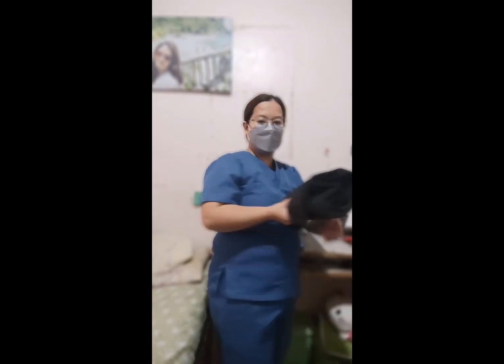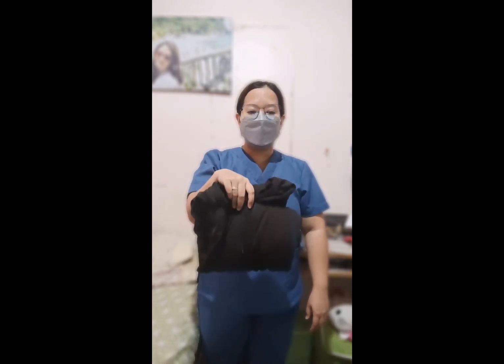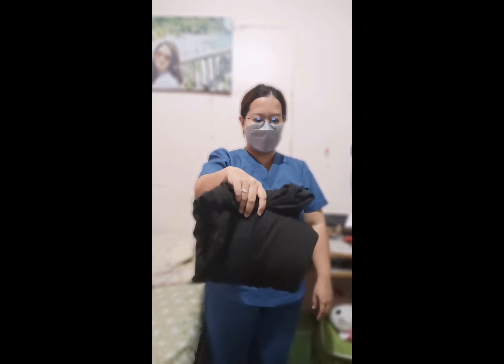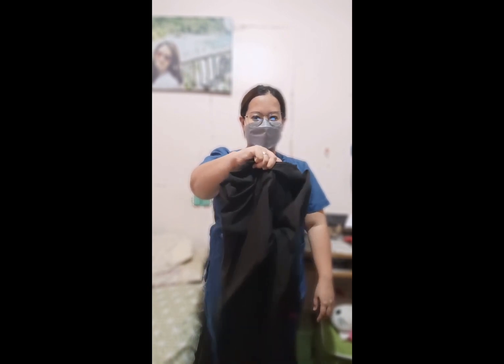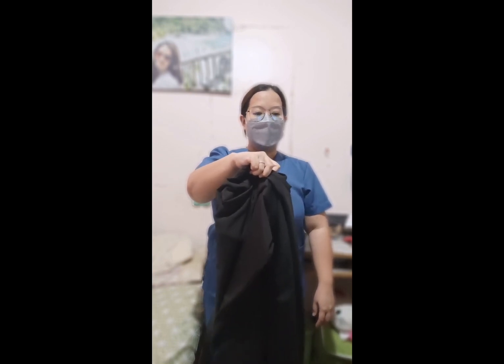And now we're ready to pick up the gown. To pick up the gown, with one hand, pick up the entire folded gown from the wrapper by grasping the gown through all layers, being careful to touch only the inside top layer, which is exposed. Once your hands are securely pinching the gown in these slots, step back from the shelf and allow the gown to drop. Make sure the gown does not touch any surrounding non-sterile objects.